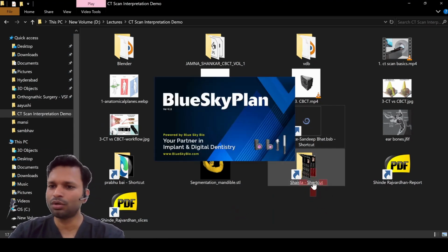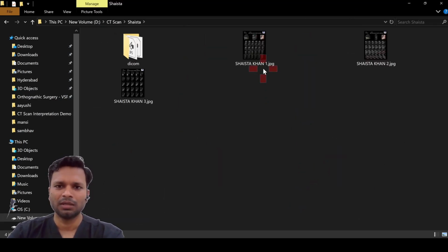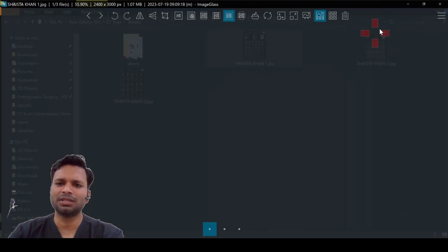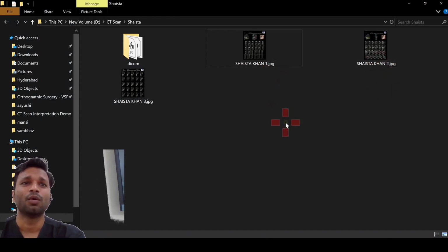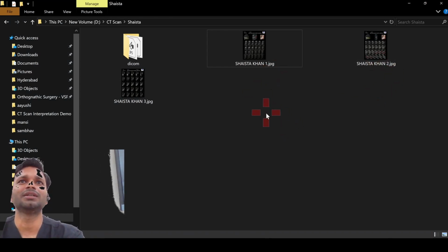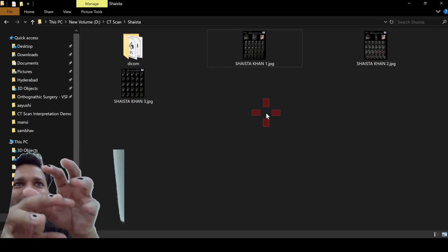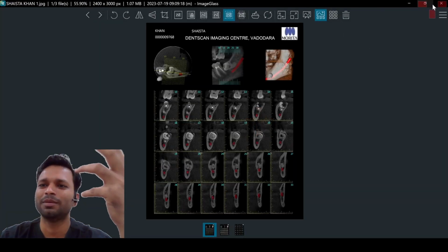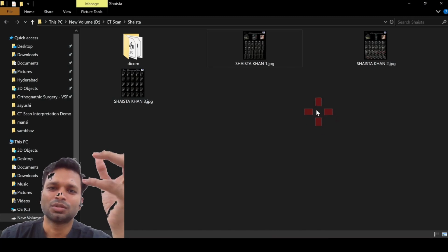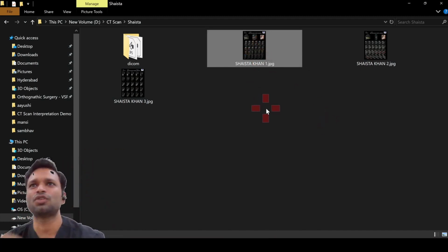Now another thing I want to note. Do you see these images? .jpg लिखा है सबके पीछे. What are these formats? .jpg, images or pictures, right? ऐसे images के format होते हैं BMP, JPG, PNG, GIF. These are all image formats जो आप अपने कोई भी phone में open कर सकते हो या कोई image viewer में open कर सकते हो, right? So इस एक image को, JPG image को open करने के लिए we have different softwares to open this single image.